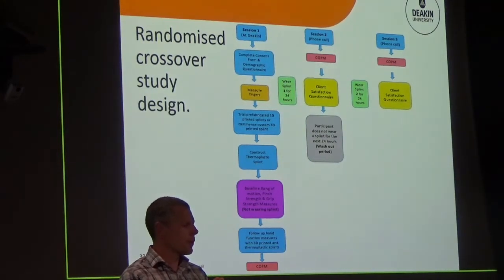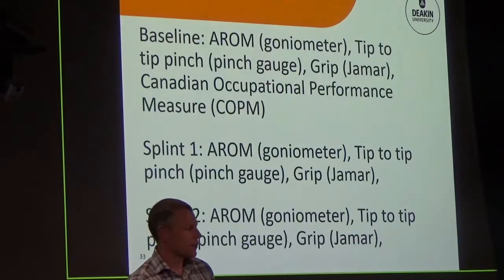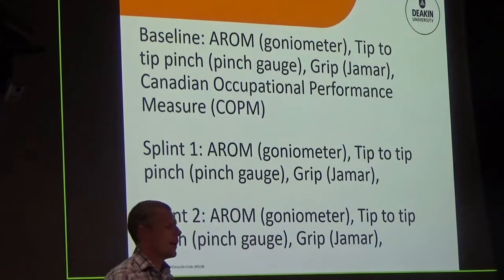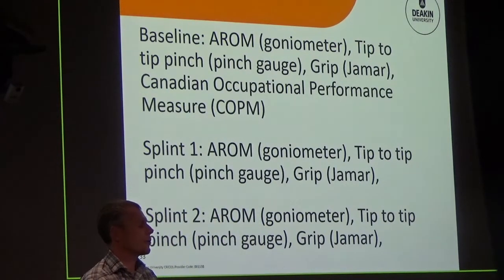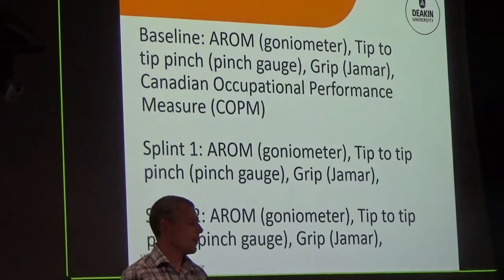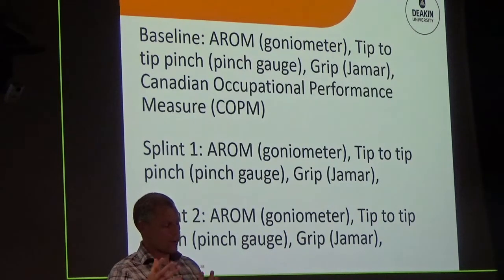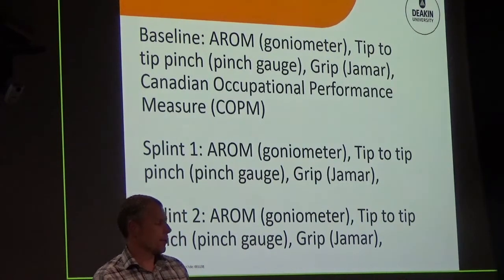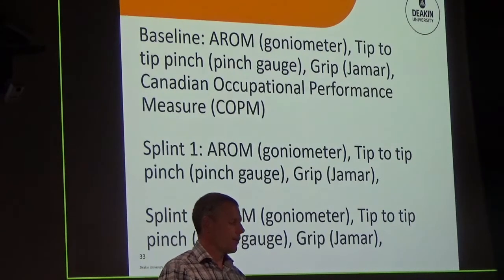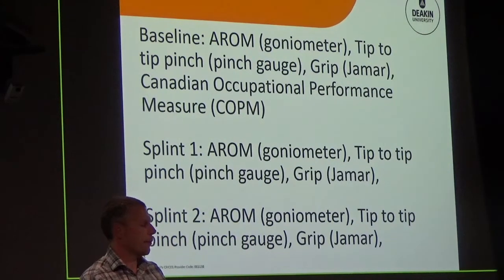In the measurements that we did, in the outcome measures, at baseline we did active range of motion, in extension and flexion, we did tip-to-tip pinch, as you can see there, grip, and the Canadian Occupational Performance Measure. And then that was the baseline measure on the first session, and then they put their splint on, whatever they were randomly allocated to, and did those measurements again, and then they put their second splint on in that first session and did those.